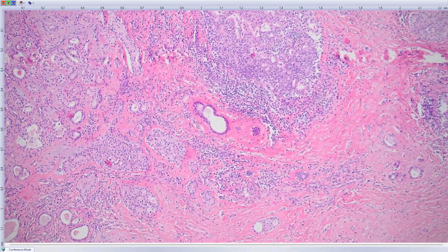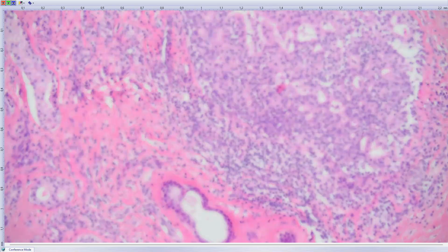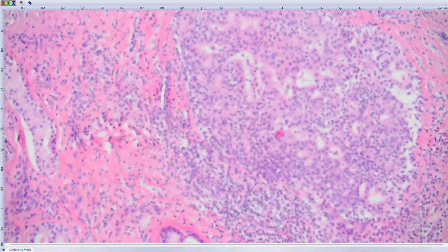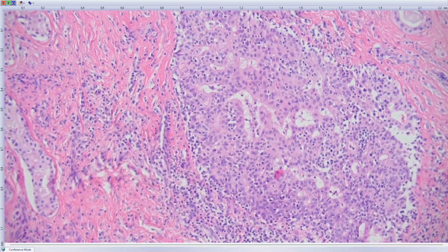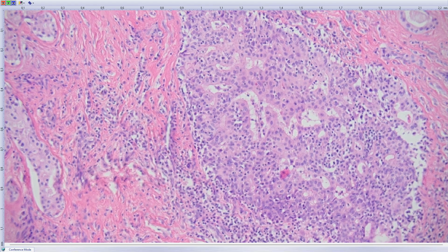Which is the best one? For example, here. You may notice that they have interesting characteristics that are well known from other tumors. Yeah? They are sometimes indistinguishable from mammary analogue secretory carcinoma. And these proliferations are in 100% of sclerosing polycystic adenosis with intraductal proliferation.